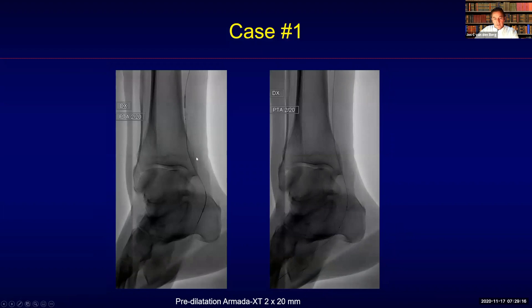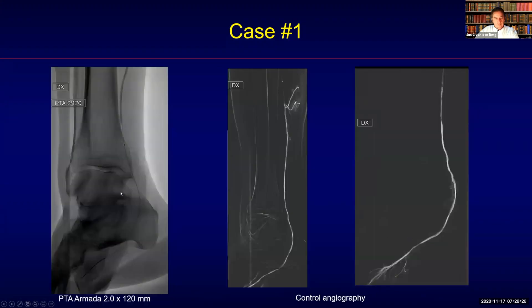Then a second pre-dilatation was performed with a 2x20 because the larger balloon still did not follow. Here you can see the XT 2x20 now positioned very distally, and then we could finally deliver the therapy over the entire segment.